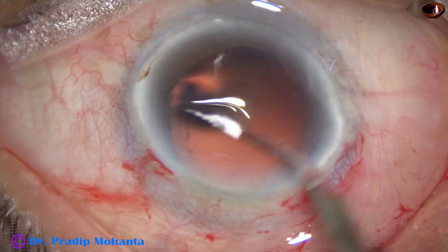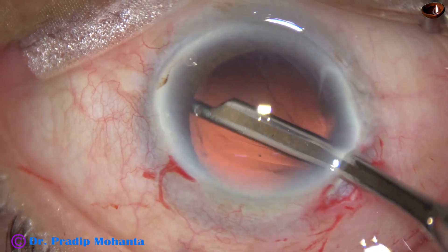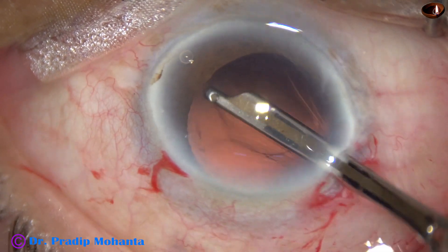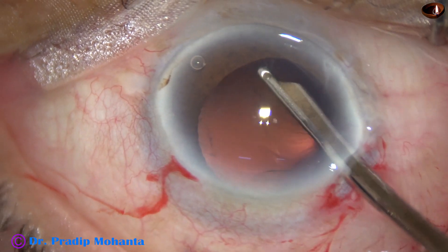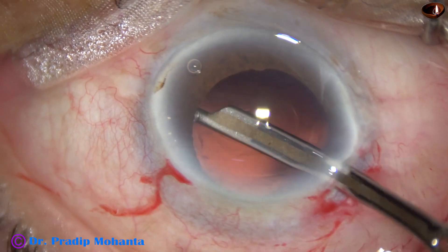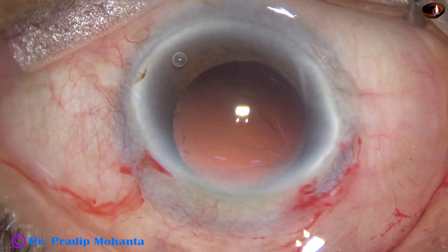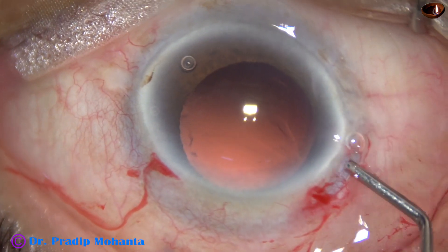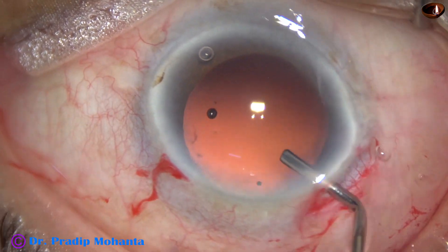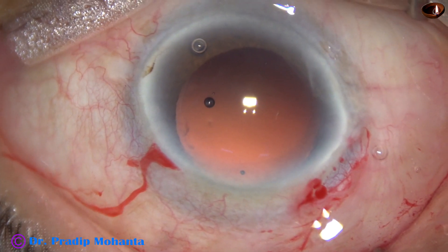In this case, there is hardly any cortex. There are some small fibers, probably. Yes, there are some small fibers — those are removed.